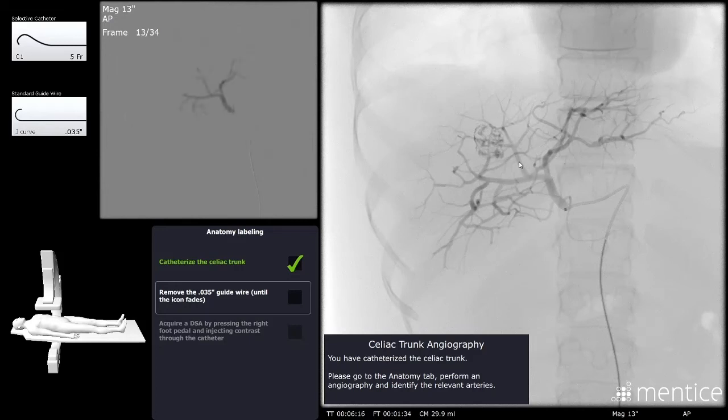Once you are happy that you have your microcatheter in a position that is acceptable, and that you have found the arterial feeder that is supplying this tumor, at that stage you are then in the position to perform your chemoembolization procedure. Now, depending on what center you work in, that embolic might be different. So you have lipiodol TACE, you have DEB TACE, and these are all different chemical modalities or particles and chemicals that are used to help to treat these lesions.